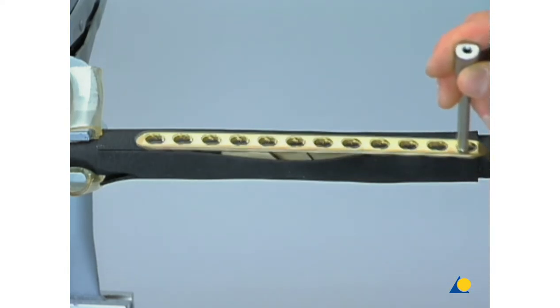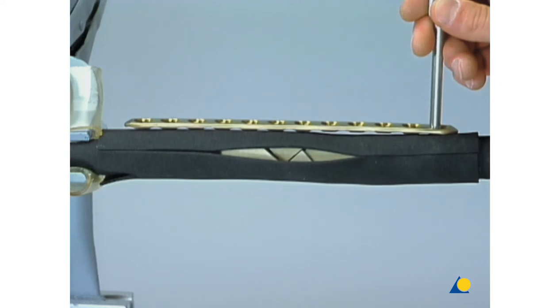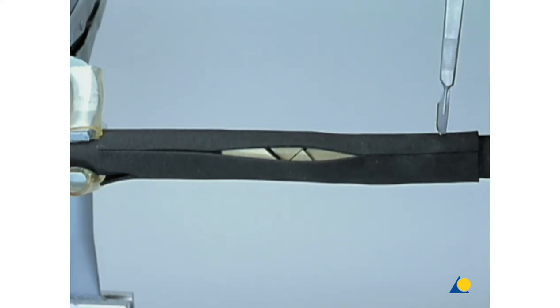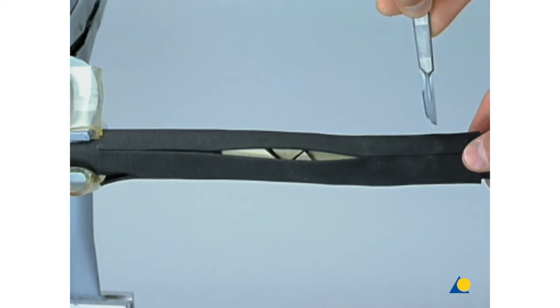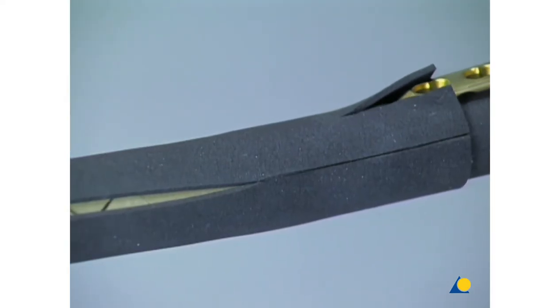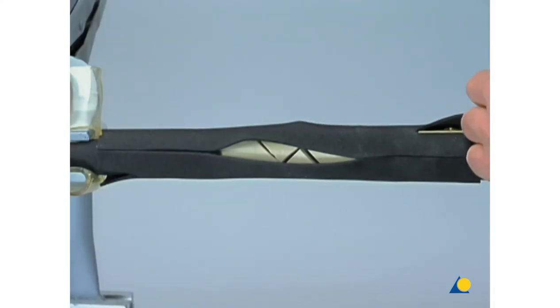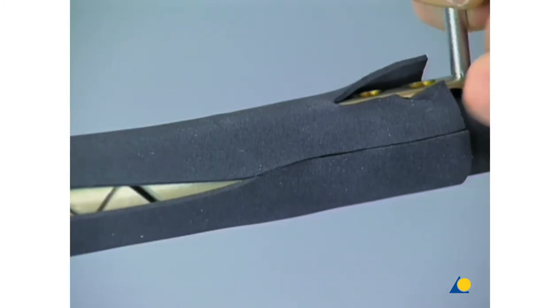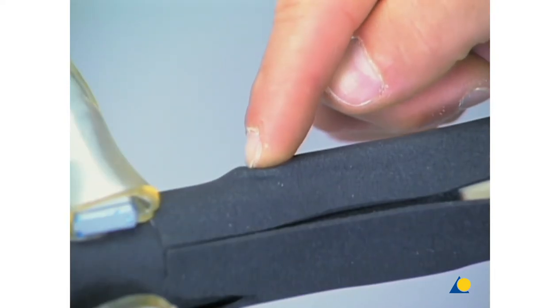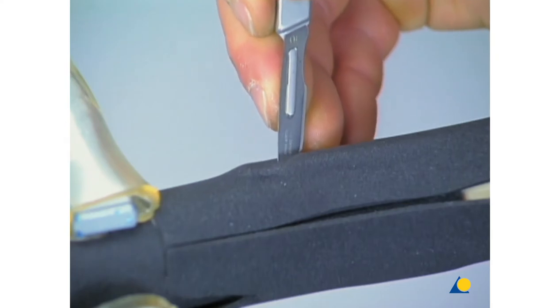The 12-hole LCP will be used to bridge the fracture. The plate is held against the bone with the LCP drill sleeve. The required position is adjusted using the image intensifier. At one end, a small incision is made down to the periosteum. The plate is gently introduced and slid under the soft tissue cover in the epiperiosteal layer. During insertion, the position of the plate should be monitored with the image intensifier. After palpation of the plate, a second short incision is made to allow the second drill sleeve to be firmly screwed into the end hole of the plate.